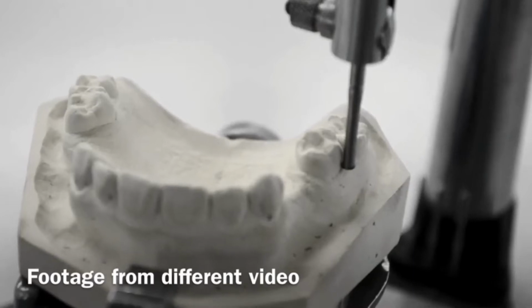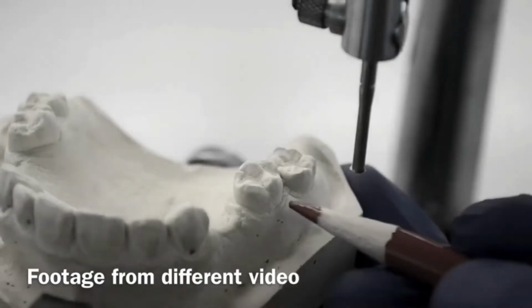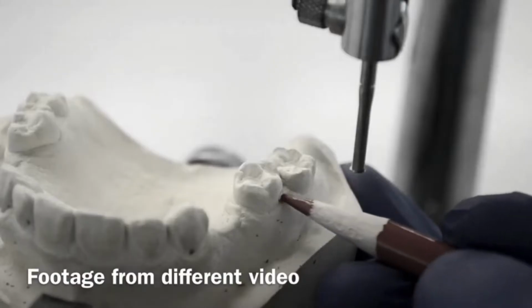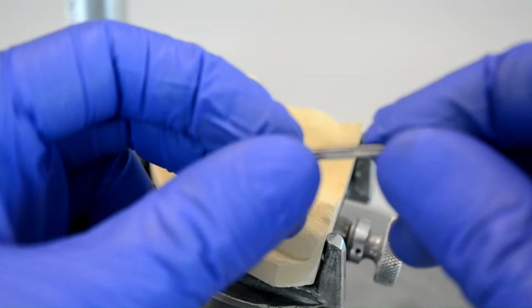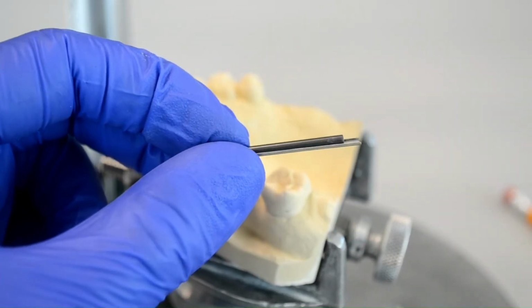Occasionally, we'd find that a tooth does not have the undercuts that we set out to find. This issue can be resolved in a variety of ways. However, in the design phase, we will mark that area for modification using a red pencil. Now that we're done identifying all the different undercuts, it's time to draw the survey line.